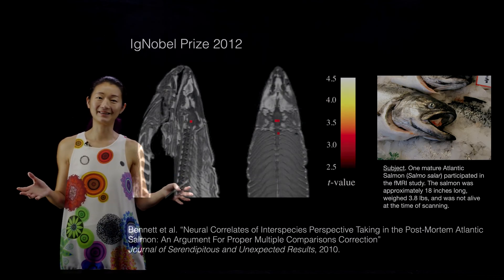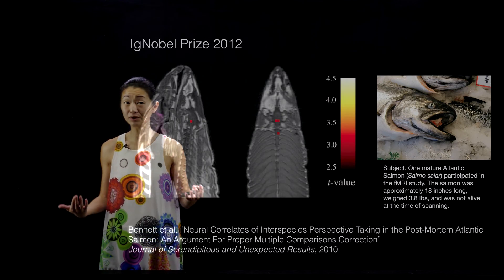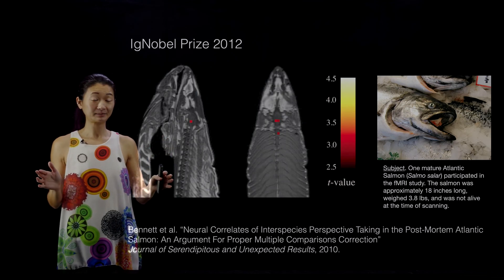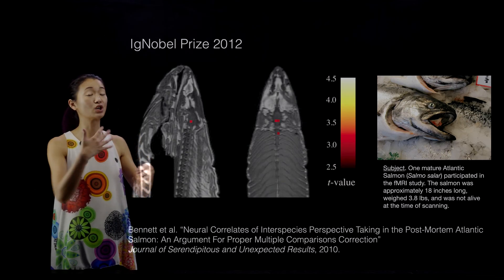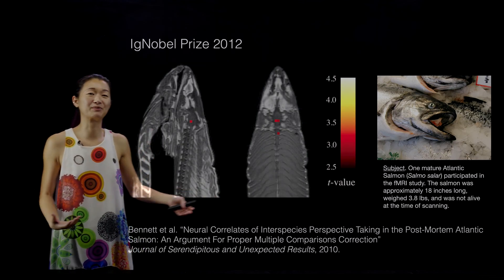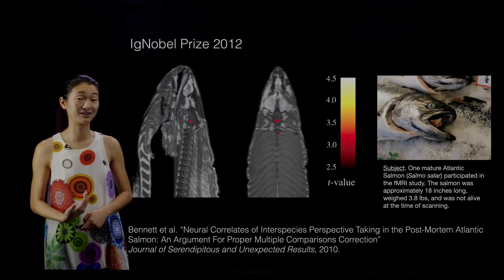They obviously knew what they were doing and wrote a very snarky paper published in the Journal of Serendipitous and Unexpected Results in 2010. The point is not that this is full of nonsense — it's that the version of the software they used did not properly account for what's called multiple comparisons correction. This is a statistical term meaning that when you are looking for something statistically significant not in one or two measurements but across a gigantic set of measurements like all the voxels in the brain, the chance of finding it in at least one of those independent tests is not low. You have to correct for the number of voxels and multiple comparisons you're making. This is a statistical result written up in a charming way to poke fun at the fact that we must be really careful with our data analytic methods.